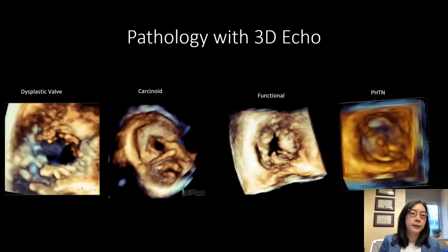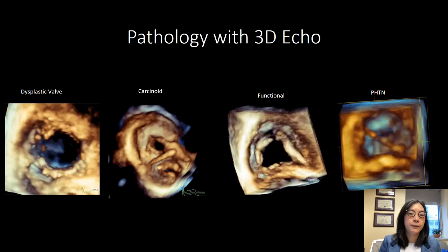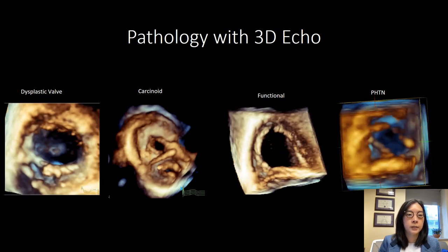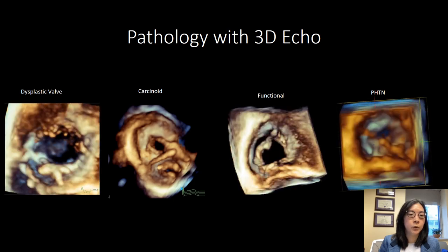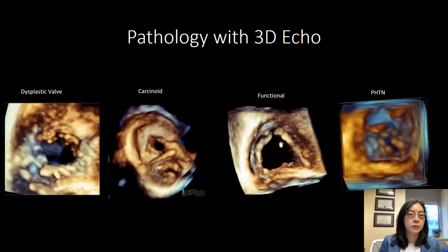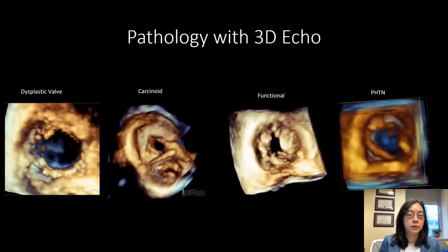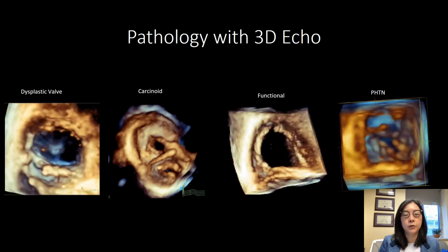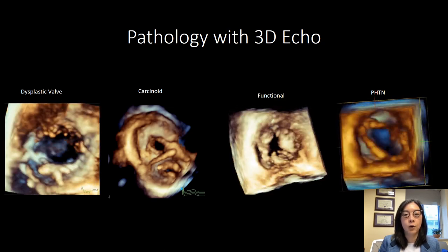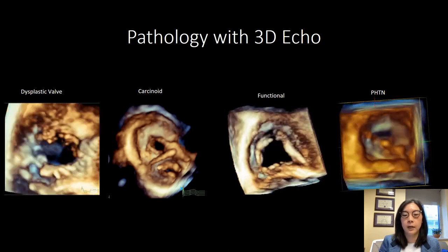Beyond identifying leaflet morphology, you can actually identify pathology with 3D echocardiography. Going from left to right, there's an example of a dysplastic valve with abnormal chordae, a patient with both mitral and tricuspid carcinoid syndrome showing thickened restricted tricuspid valve leaflets, a patient with functional tricuspid regurgitation where the leaflets are highly mobile but do not coapt in the center because of RV dilatation, and a patient with pulmonary hypertension.